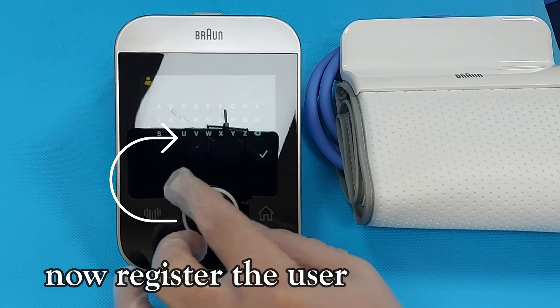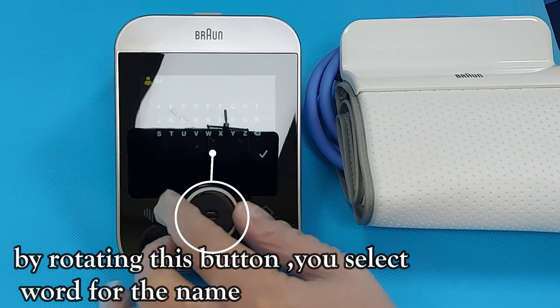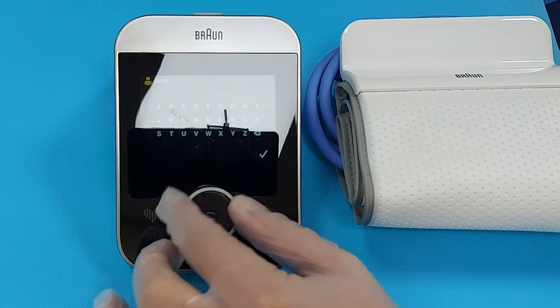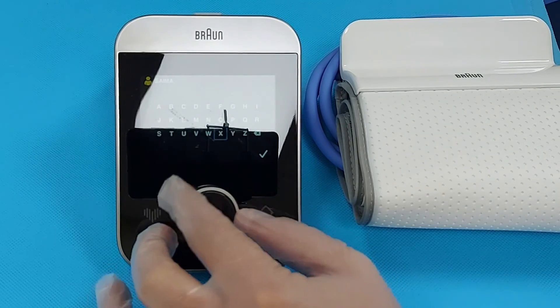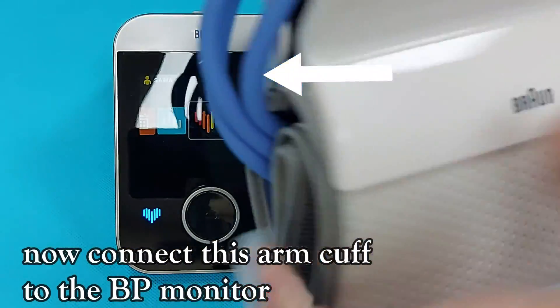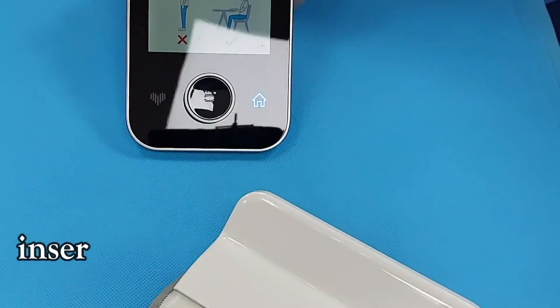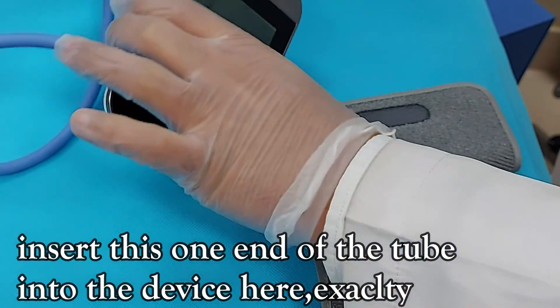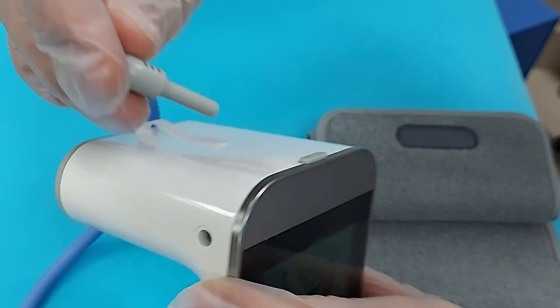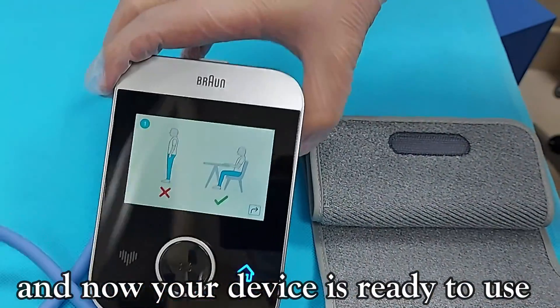Now register the user. By rotating this button you can select the word for the name. Now connect this arm cuff to the BP monitor. Put one end of the tube into the device here exactly, and now your device is ready to use.